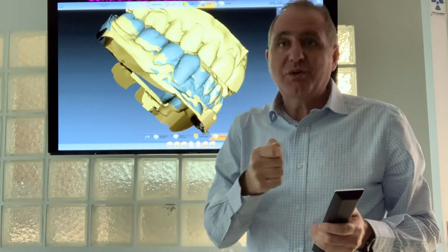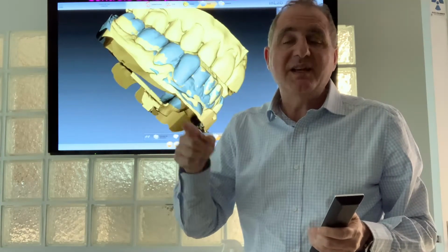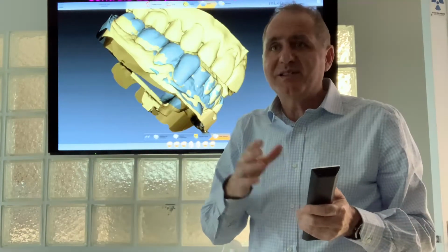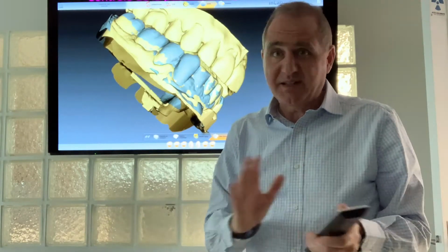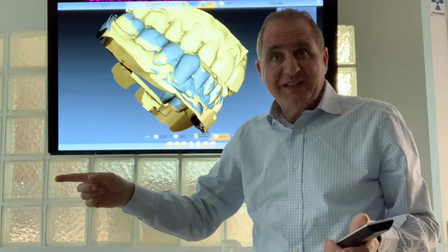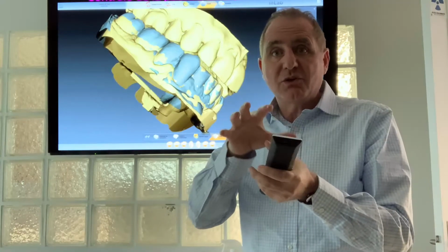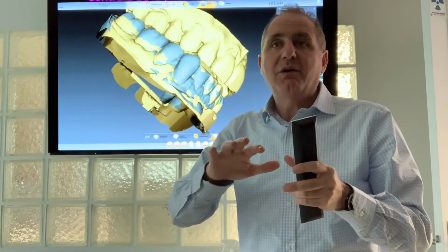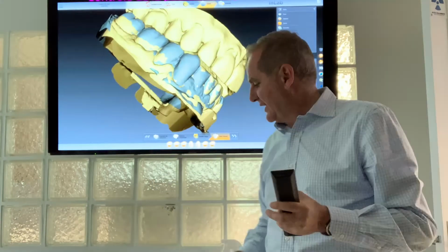Centric relation is not reproducible every time, and with every patient, every time you do it, you can have a different one. Between 10 dentists, if they make the centric relation for a patient, you will see that the 10 are different. So for me, it's not scientific. The only way to recognize it is by swallowing, registering digitally many times, and comparing digitally all the models overlapped together, to see where the best one is and where the bad decision is.